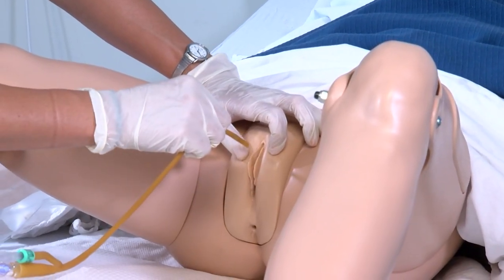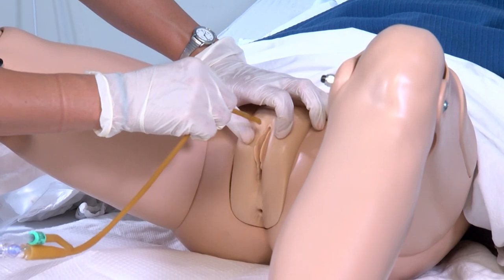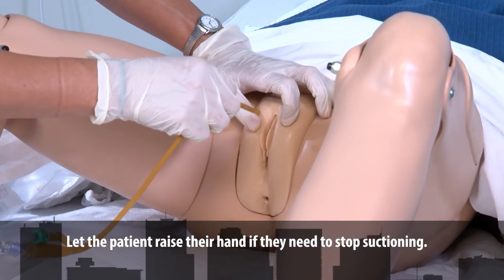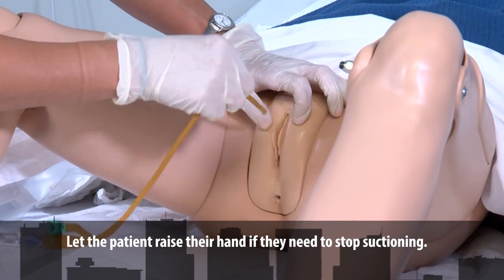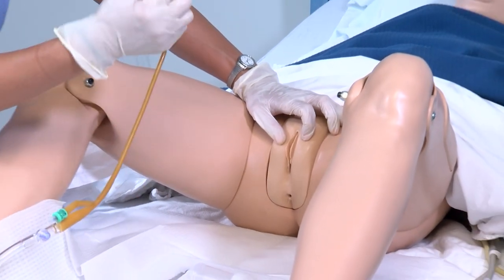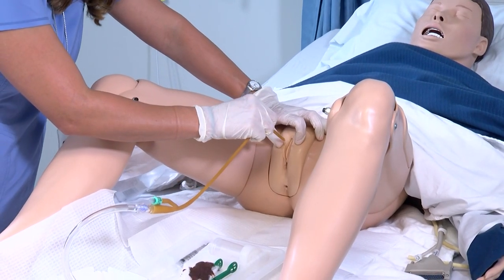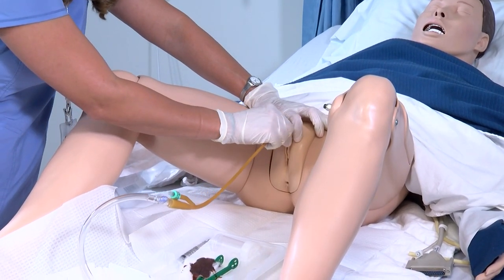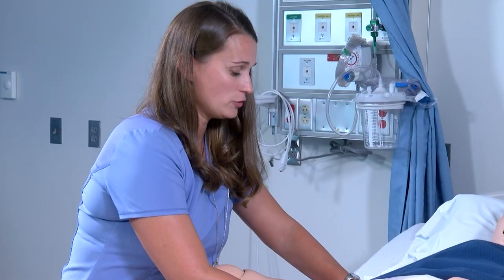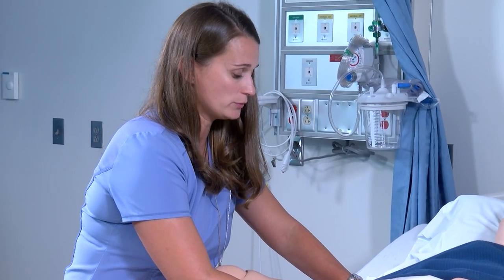If you place the Foley in and meet resistance or it's not going in right, you cannot pull back and try to reinsert — that would be a point of contamination. It needs to be a clean insertion. One shot is all you get to try to get that catheter in smoothly. If you contaminate your Foley, you will need to get a new catheter and start over.